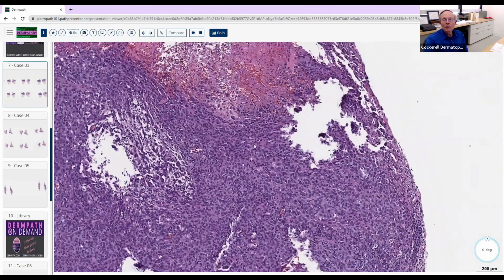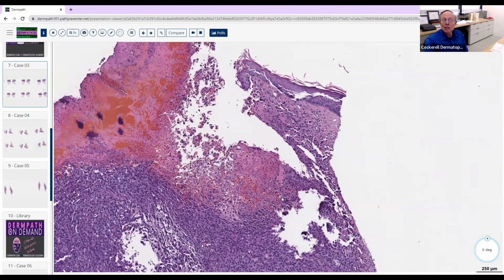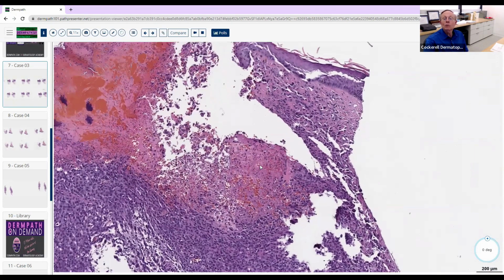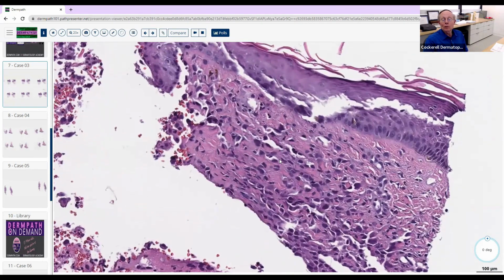As you know, these patients do really terribly. And this is an example of necrosis en masse. It's where the cancer is dying. If you look in this area up here, sometimes you have to look really hard to find the clues, if you will. So if I just showed you this field, you might think angiosarcoma here, right? Because it's got the little slit-like spaces. It's got the atypical endothelial cells protruding into the lumen. So this one little area out of the whole thing is suggestive of angiosarcoma.